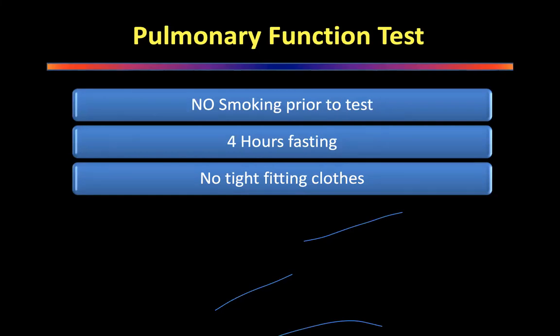So it is important that the patient should be wearing loose fitting clothes, no tight fitting clothes, otherwise they will obstruct, they will actually give you erroneous readings on the PFT.